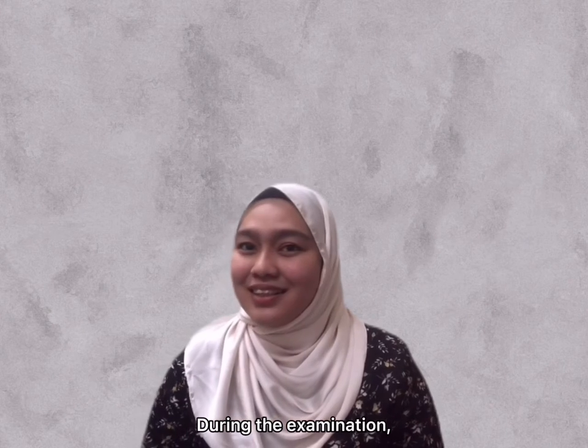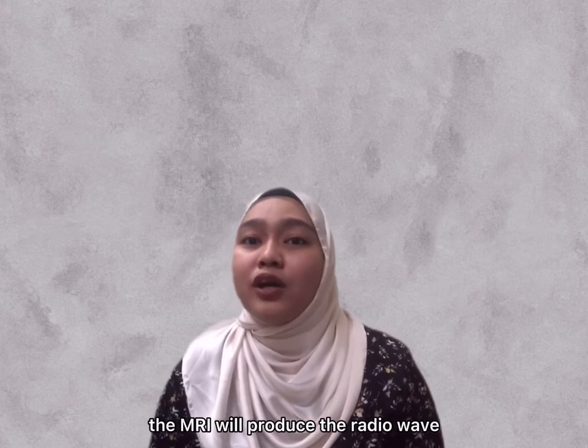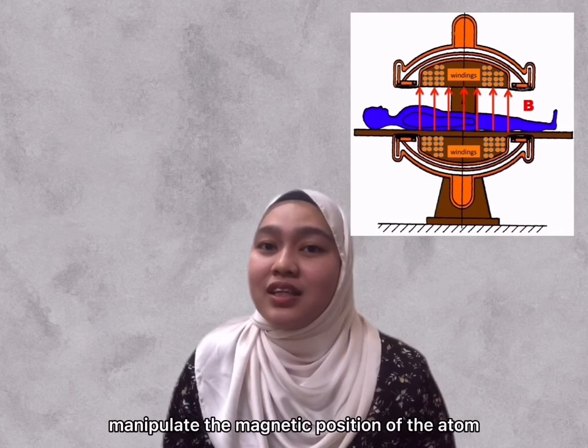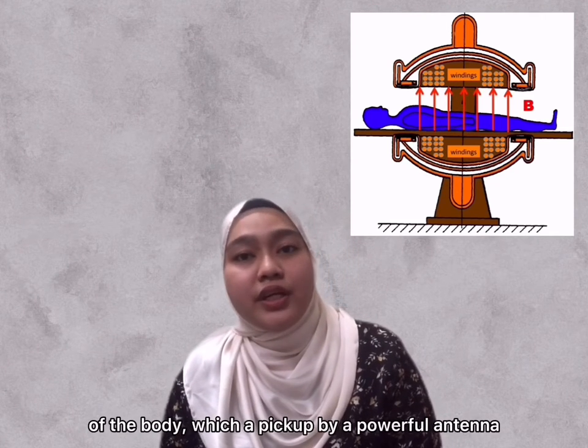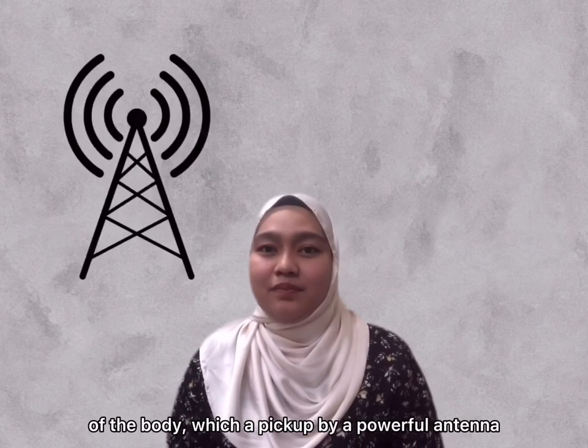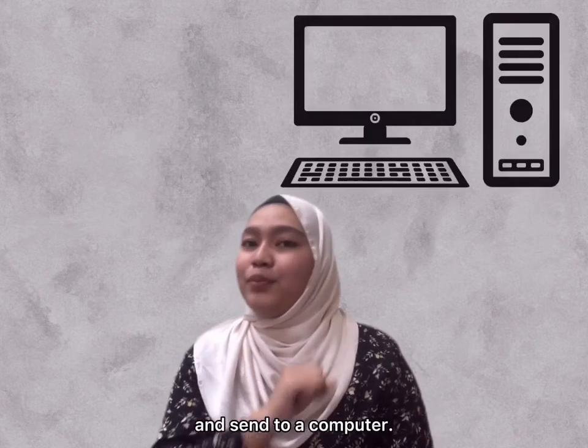During the examination, the MRI will produce radio waves that manipulate the magnetic position of the atoms of the body, which are picked up by a powerful antenna and sent to a computer.